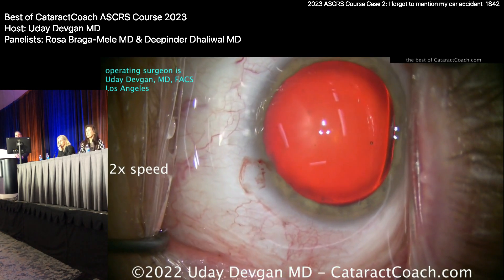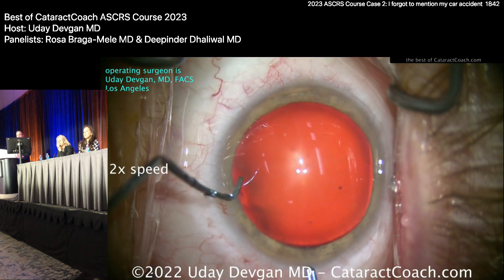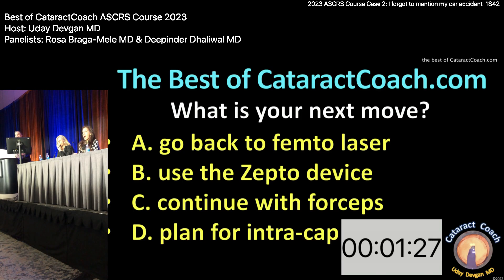Making the main incision here, getting the rhexis done. I poke in with my forceps and here comes the rhexis — and, well, tell me what are we going to do here. I'll keep trying, but what's the plan? Go back to the femto?